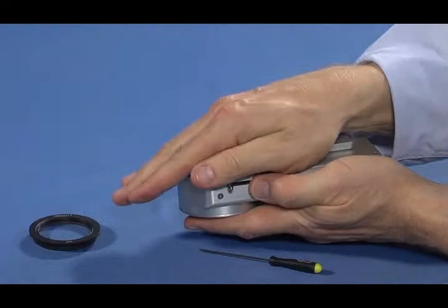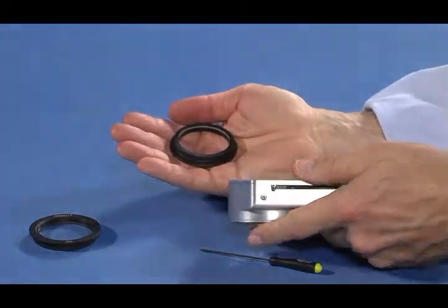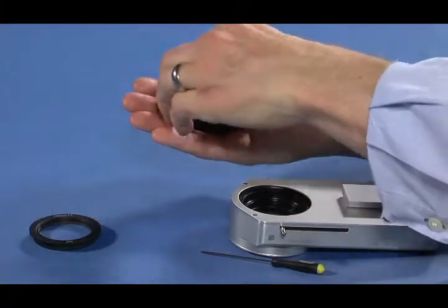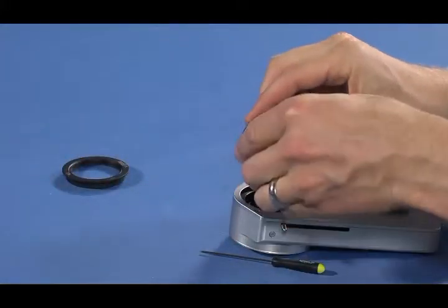When the condensing lens is loose, cover the top opening of the CLA housing and turn the CLA upside down to allow the condensing lens to fall into your hand. Insert the replacement condensing lens into the CLA.